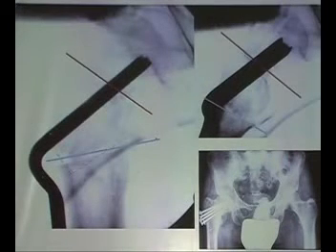So the solution is to transpose the fracture line into a more horizontal one. Not completely horizontal, you can't do that, because that's too much valgus, but about 30 degrees. And in the axial view, in the Lauenstein view, you have to reconstruct it properly, and then you do the intertrochanteric osteotomy, that is here, the line. I cut through, transverse, and then I impact the proximal fragment into the distal fragment, so it gives rotational stability.